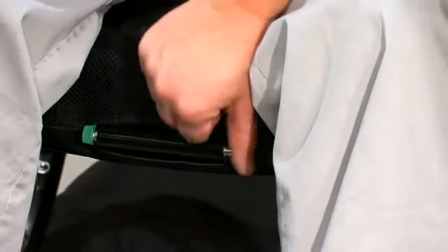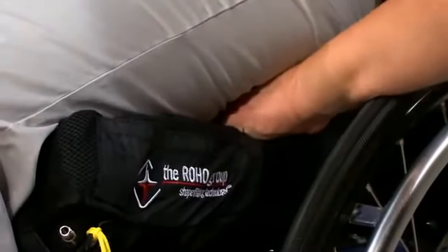Once the air transfer is complete, push the isoflow's red knob toward the left into the locked position. This will isolate the flow of air and provide a more stable sitting position. Recheck each compartment of the cushion to ensure proper inflation.